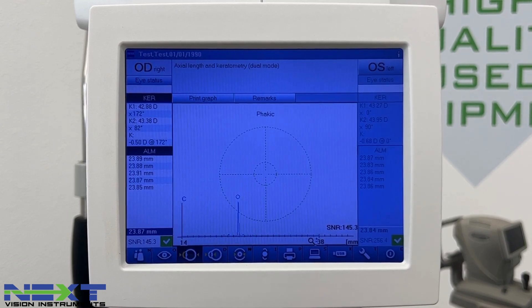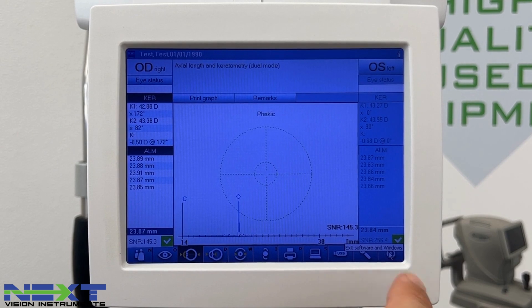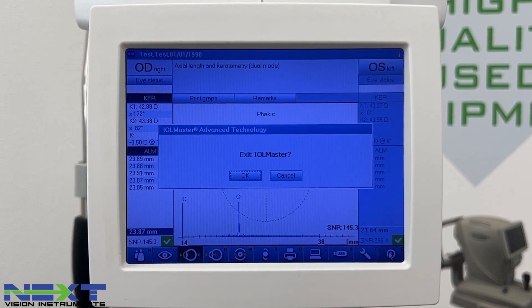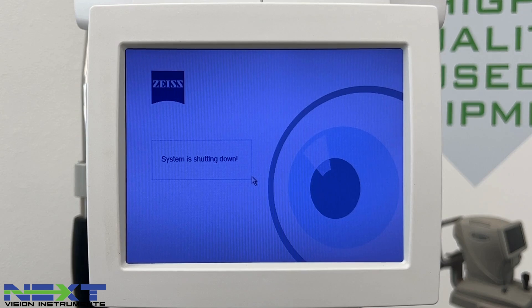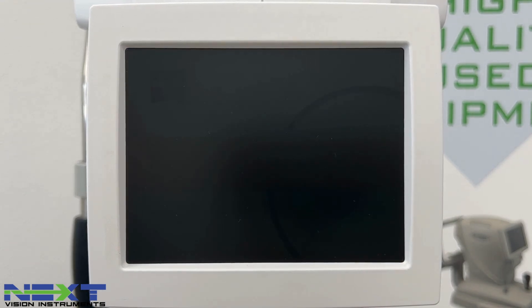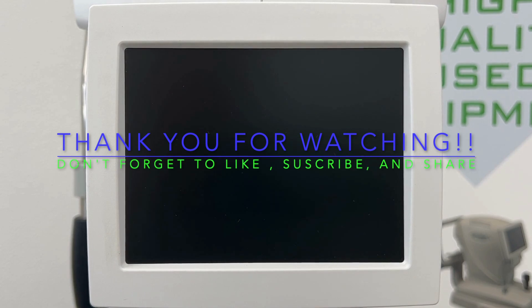At the end of the day when clinic is over, come to the button all the way on the right-hand side, click it, and select Exit IOL Master. Click OK — the system will begin shutting down. Once the screen goes off, flip your power switch and be sure to cover the unit with a dust cover.